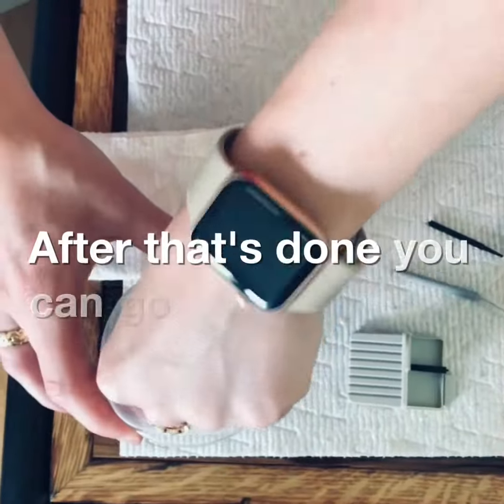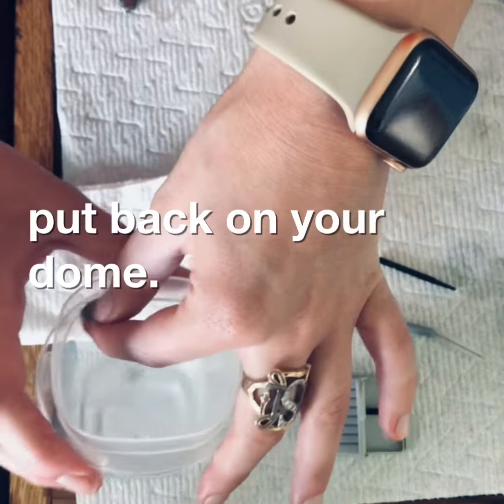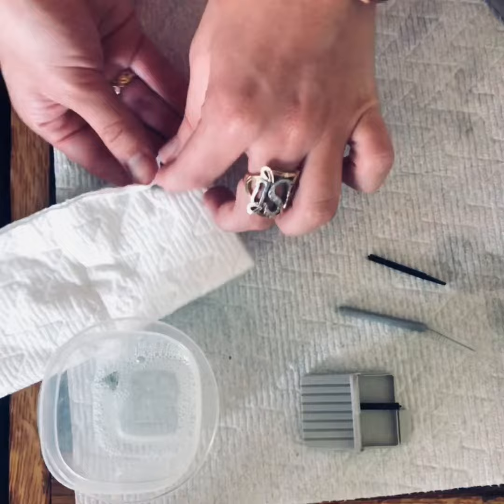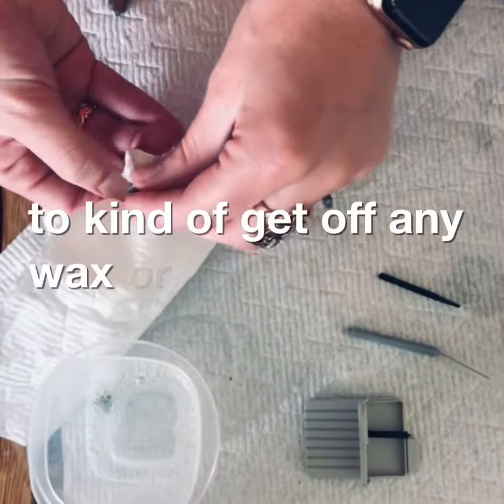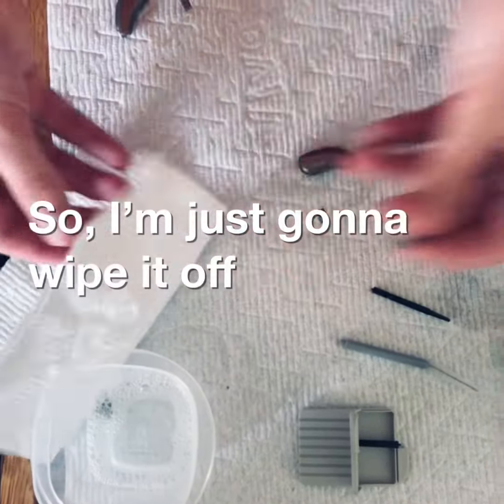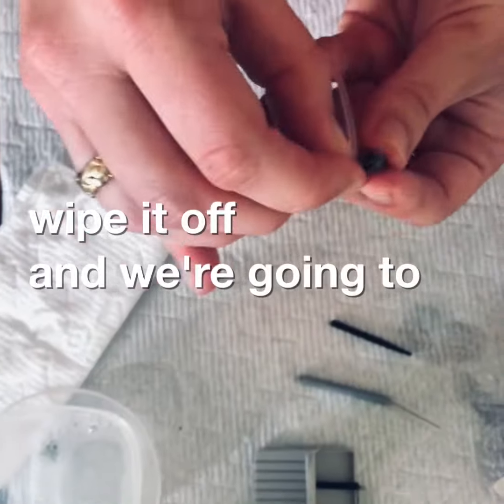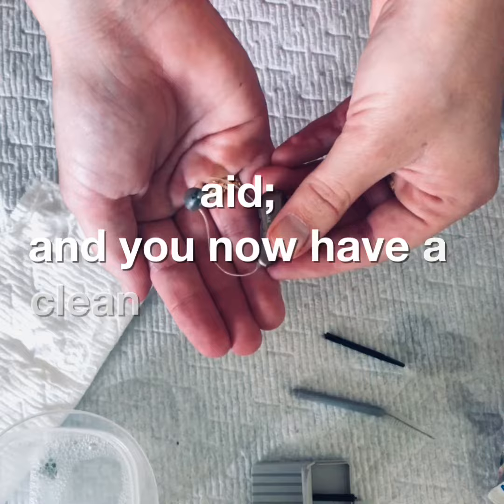After that's done, go ahead and put back on your dome. This has already been soaking in warm soap and water to get off any wax or debris. Just wipe it off, pop it back on the hearing aid, and you now have a clean hearing aid.